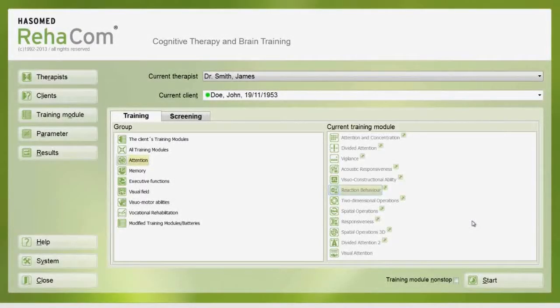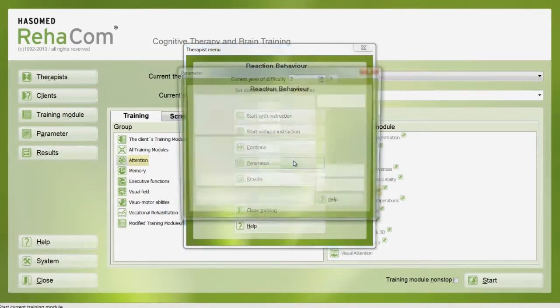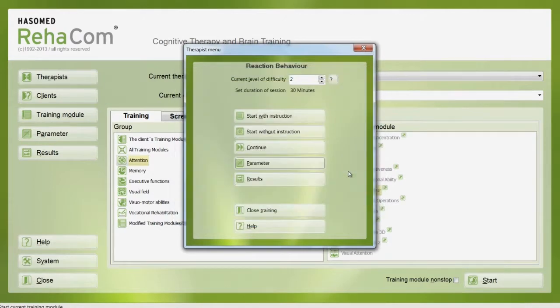Before starting the training module, it is possible to individualize the training parameters. Via the therapist menu, one can adjust the level of difficulty, duration of session, instructions, help, or stressors according to the patient's needs. It is possible to change these parameters at any time during the training.